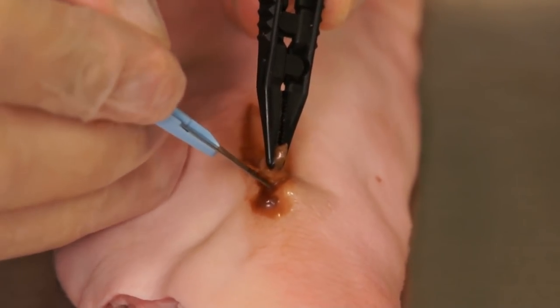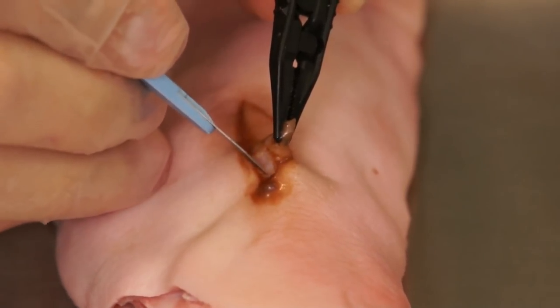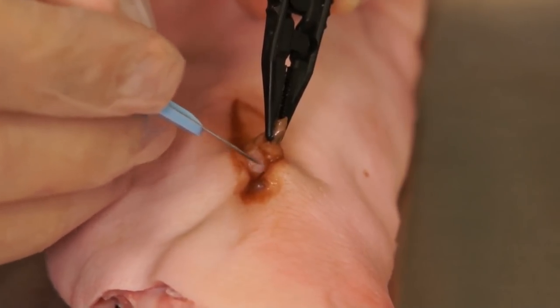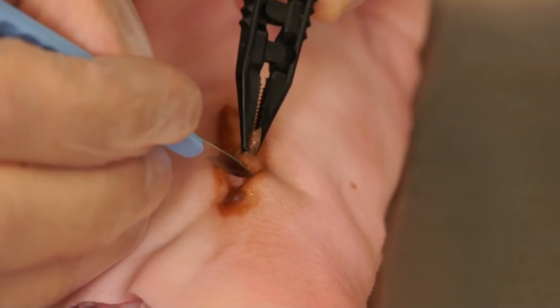This is where debridement should begin. A small incision at this interface is made to create a leading edge. This is then elevated using the forceps or the dermal curette.